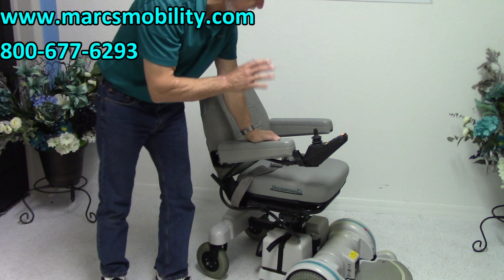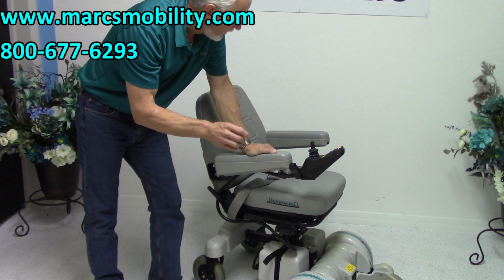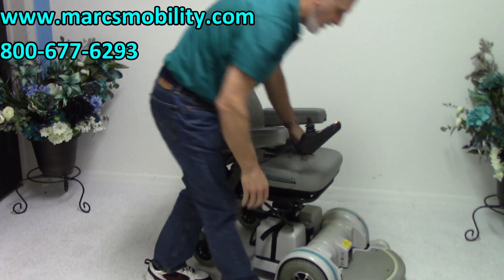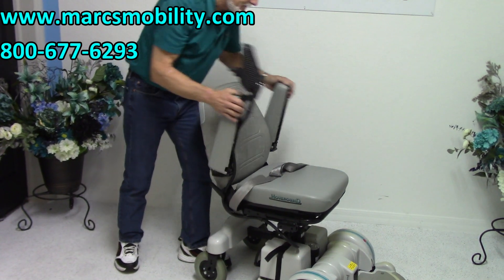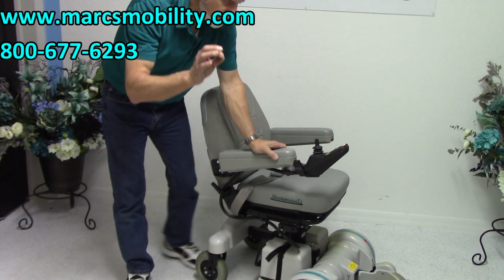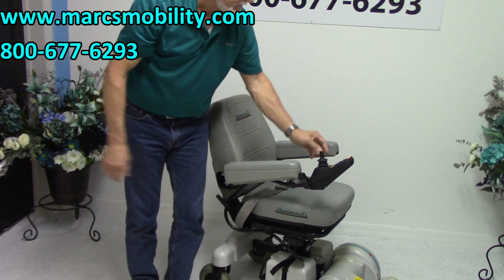So if you're looking for a nice power chair with really powerful motors, a round footplate, a nice 5-inch seat lift, adjustable arms, a nice cushion with safety belt — and Hover-Round is a very well-liked brand — this is a really nice one.